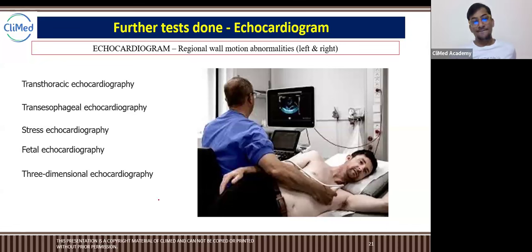Yes, it detects the blood flow by echo sound produced by the echo probe. Ultrasound, absolutely, Hima, Ankit. This is the echo sound. This is completely based on ultrasound. It takes the sounds from the heart, the flow of the blood, and based on that, it depicts the picture here on the screen. This is nothing but ultrasound. It captures the sound, and based on the sound, it creates the image.